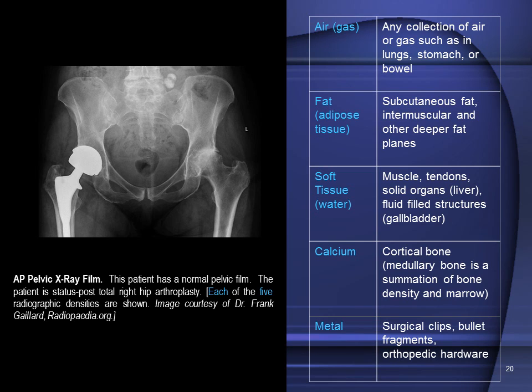So air in the gut tube, air and fecal matter mixed in the gut tube, in this case flatus, and air or flatus in the rectum. Fat or adipose tissue along the hips, bilaterally, and again, this is the pelvic bone on the right, pelvic bone on the left, iliac crest left, iliac crest right. We see the spinal column with the sacrum. We can even see the anterior sacral foramina bilaterally.